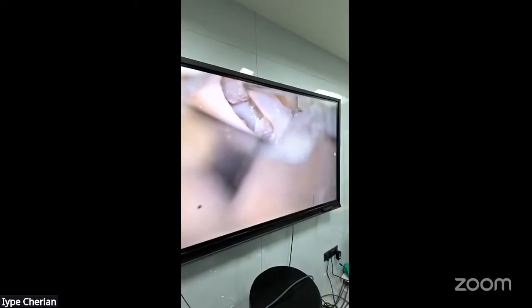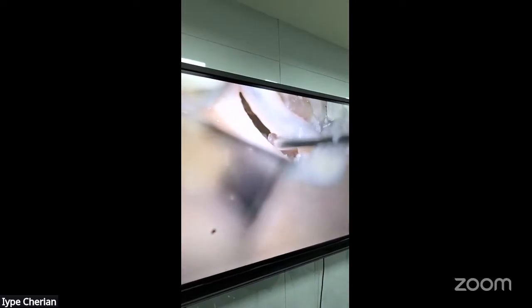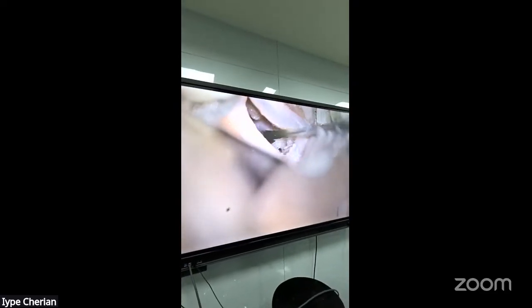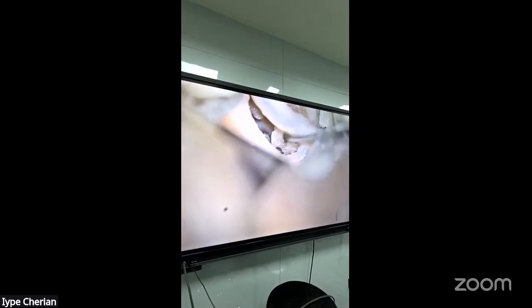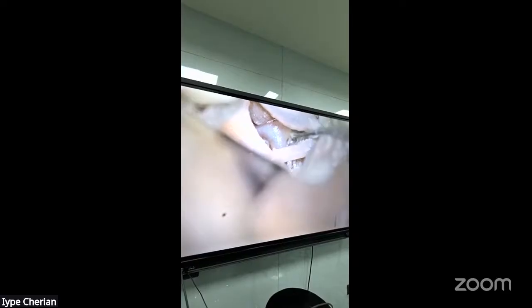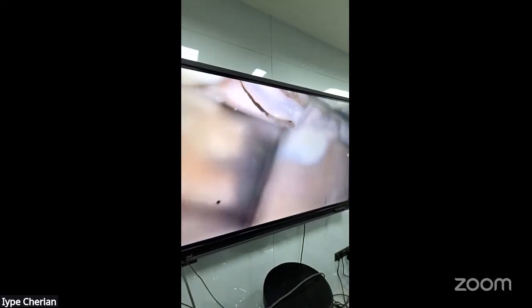Can you turn the camera so it's kind of sideways now? There you go, you can see it now. So here is the IC, this is the optic nerve, this is the lamina terminalis. In the carotid optic window, we have exposed the basilar at the bifurcation as well. So you can clip any aneurysm of the basilar. And we will go a little laterally, I will show you.